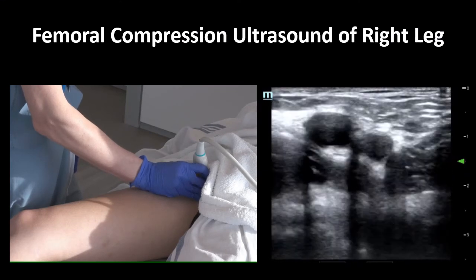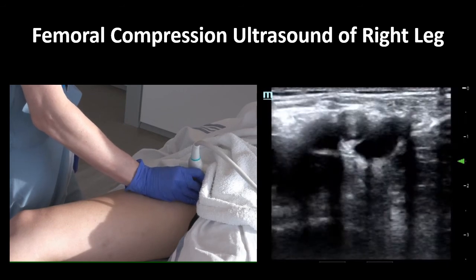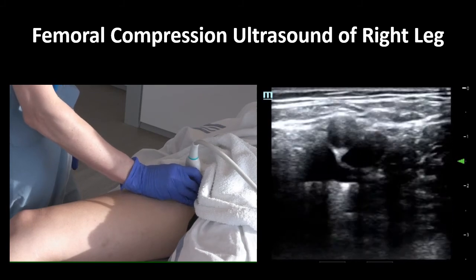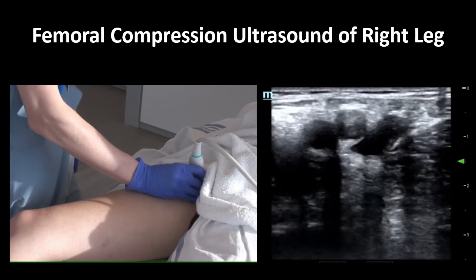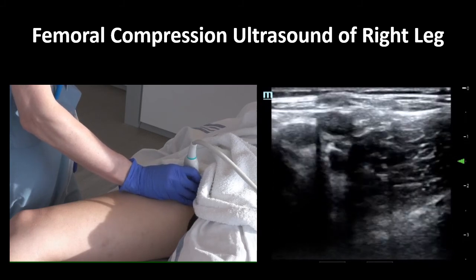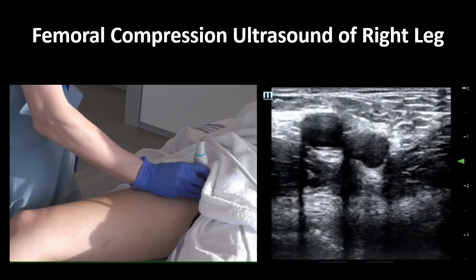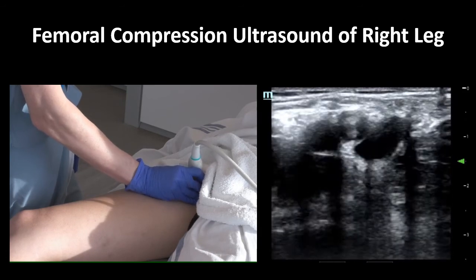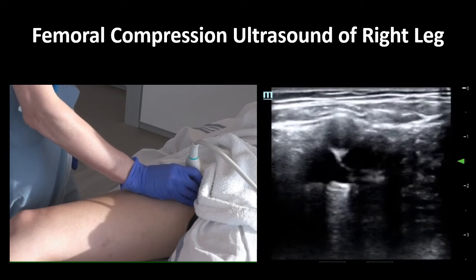Here's a close-up view of your hand position and what you should see on the ultrasound. Notice that pressure is being applied to the point that the artery is barely deformed and at this point the veins are completely collapsed. Also notice that compression is occurring at the branch points of the veins, which is where clot is most likely to form and so they're the highest yield points to scan. Watch the amount of pressure needed to achieve collapse of the veins, and notice the hand remaining anchored to the patient so that the probe doesn't slide when pressure is applied.